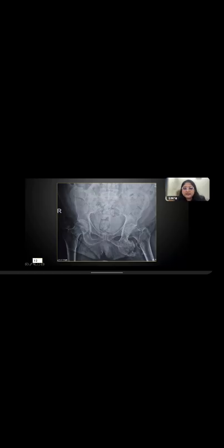Now coming to case 13. This is a spotter. You have to tell me the answer. 13.